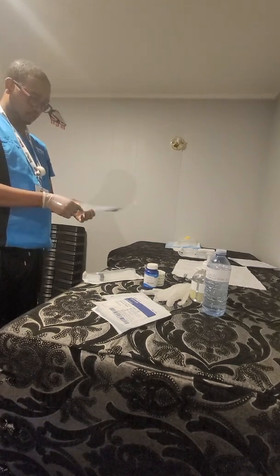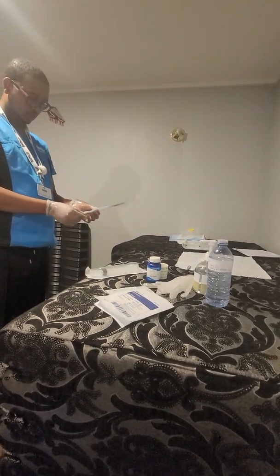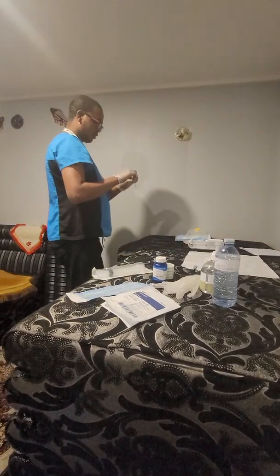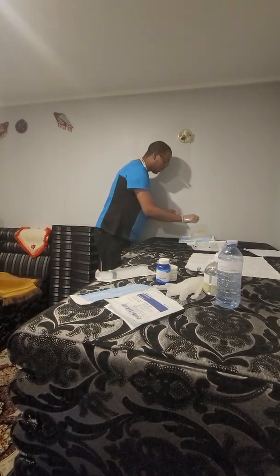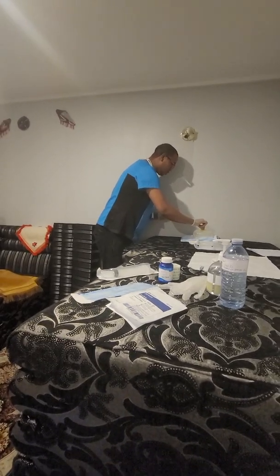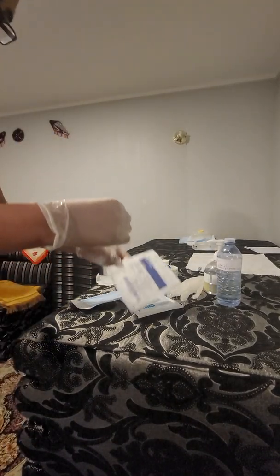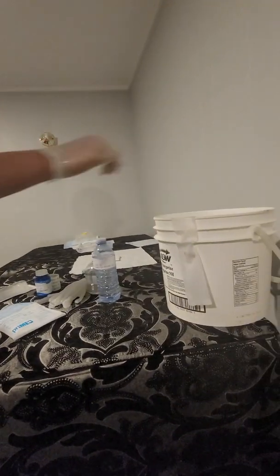Use cotton tip applicator. Keep the sterility of the tip. Soak it. And then gently assess for the tunneling or undermining, and then finally measure the depths. Okay, so measure with this one. It is half centimeter. It's gonna go garbage. This is gonna go garbage too.